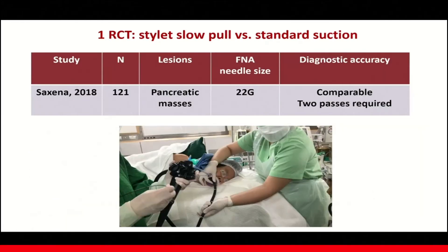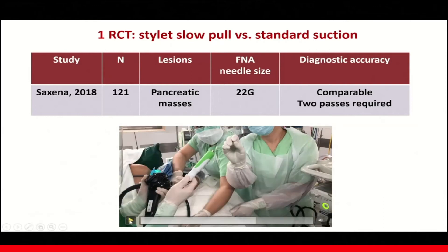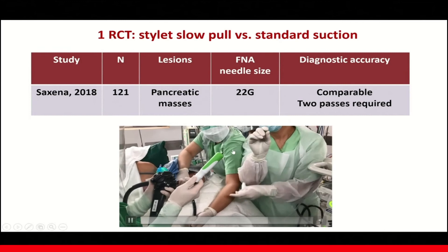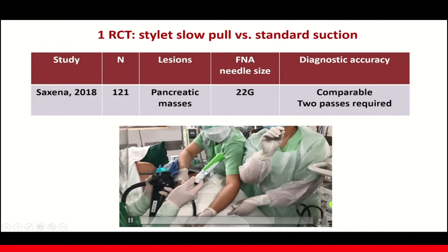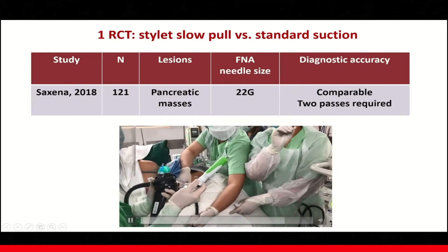In terms of the stylet slow-pull technique, a multi-center randomized controlled trial comparing slow-pull versus standard suction showed that both techniques provide comparable diagnostic accuracy with 22 gauge FNA needles, and only 2 passes were required. This video shows the slow-pull technique, where the nurse assistant pulls back the stylet slowly as you are performing the aspiration, and the fanning technique is applied simultaneously.